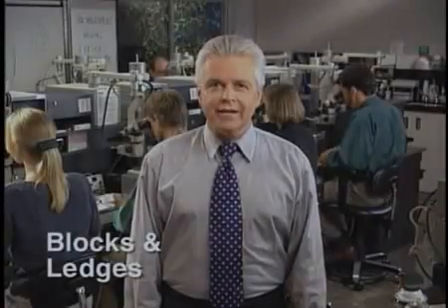A problem recognized is a problem half solved. We've seen the problems and hopefully have an idea of how to avoid the chain of events that leads there in the future. But right now we need to know how to overcome these obstacles when they do occur. Let's convert the breakdown into a breakthrough. The technique is straightforward, and I think you'll pick it up very quickly.